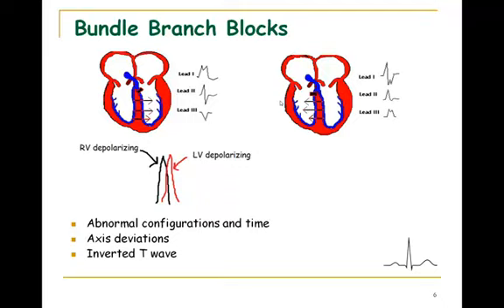With bundle branch blocks, you may also have inverted T waves. Predominantly, you will most likely see it with left bundle branch blocks, but you also will get inverted T waves, just like you would see, say, with left ventricular hypertrophy.